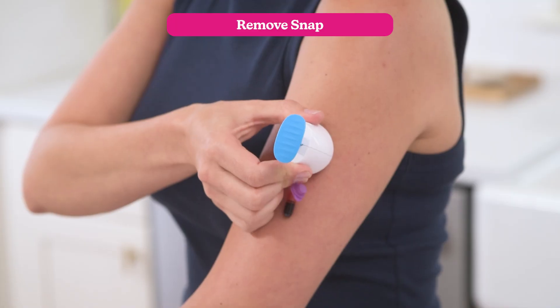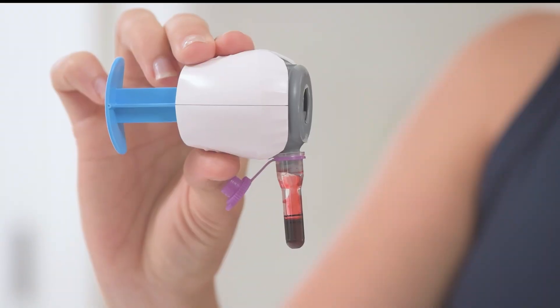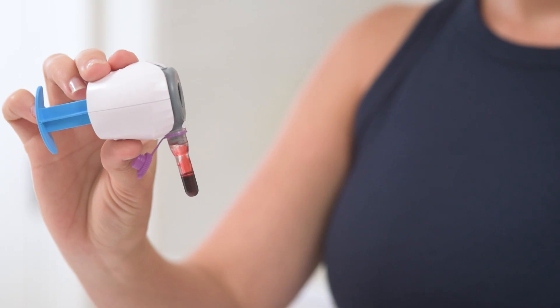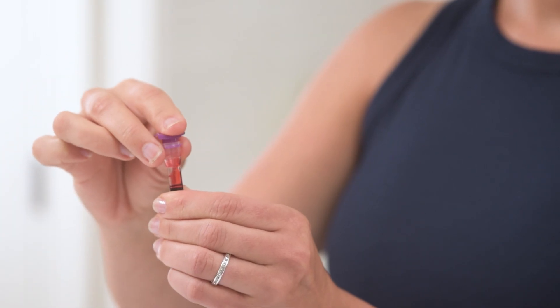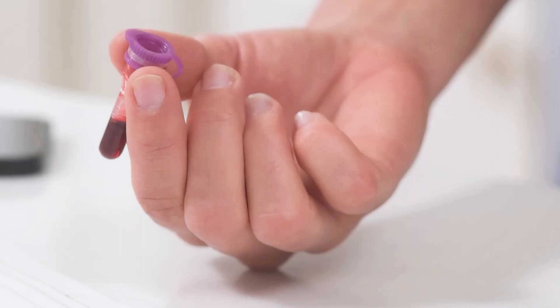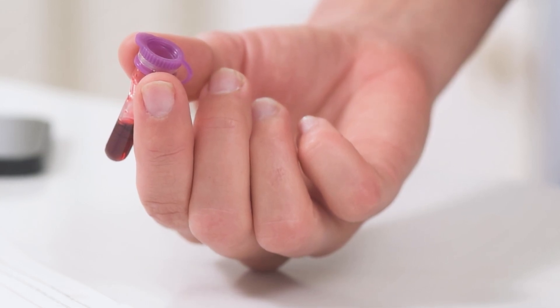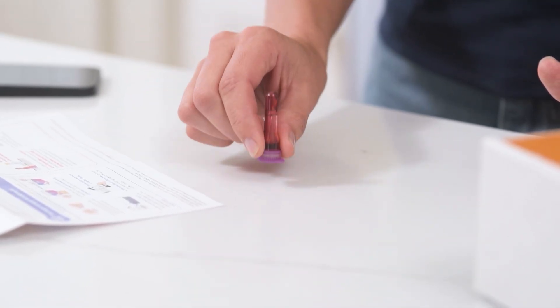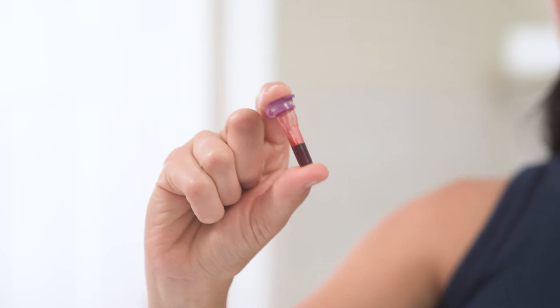Remove the Snap by slowly peeling it off. Whether your sample is slightly above or below the lines, go ahead and send it in — our lab will still do its best to process it. To remove the Snap, bend it away from the tube, then seal the tube tightly with the cap. Snap can go in your regular trash. To keep your sample stable during shipping, turn the sealed tube upside down and tap it gently on a flat surface to help break up any clots, then shake it for about 20 seconds or until the blood coats the inside of the tube.